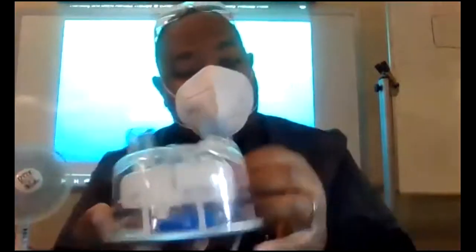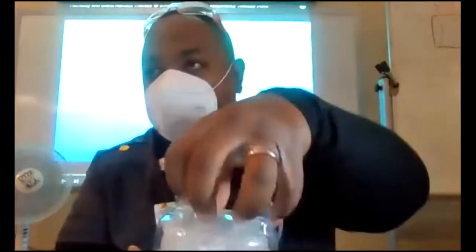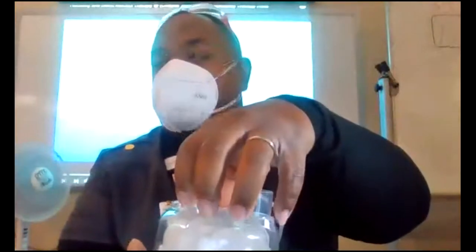If I have a Passover humidifier on the heat, it is now called a Cascade humidifier. If it's not on heat, it's simply a Passover, okay? If I put it on a hot plate and start heating the water up, it is now called a cascade humidifier. Used to be they had a tower on the top, okay? So the Passover without the tower is just a Passover. But if I put the heating tower on top, which had little wicks down in it to heat the water up, then it was called a cascade, but we don't use those anymore.